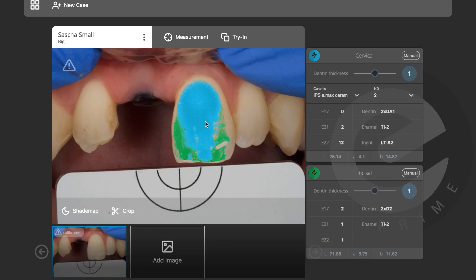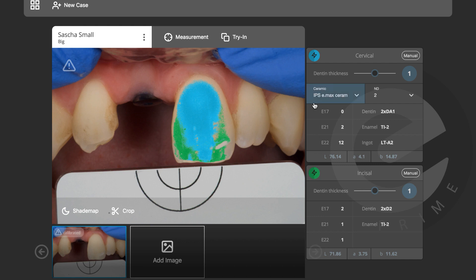eLAB is working even more cleverly now — before we had to measure in lots of sections, but now eLAB works in cervical and incisal sections. You can uncover each area with easy clicks on the little color indicators to see exactly what you have and what you're trying to copy.